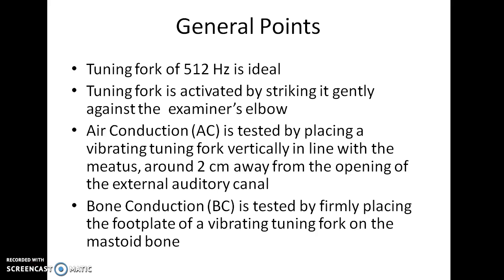Air conduction is tested by placing the tuning fork some 2 cm away from the patient's ear. Bone conduction is tested by firmly placing the footplate of a vibrating tuning fork on the mastoid process — that is, placing the base of the tuning fork over the mastoid process behind the patient's ear.